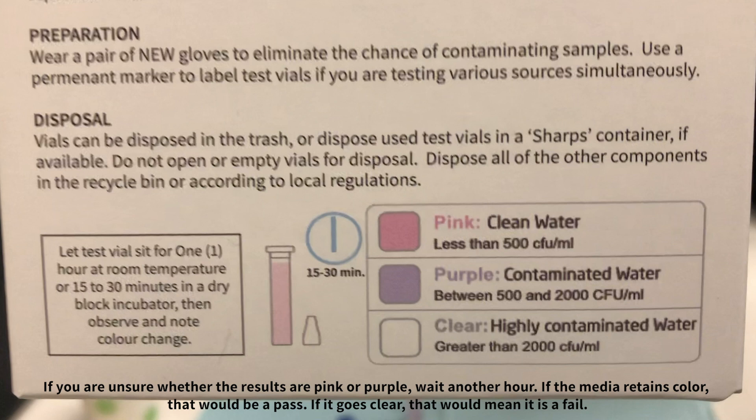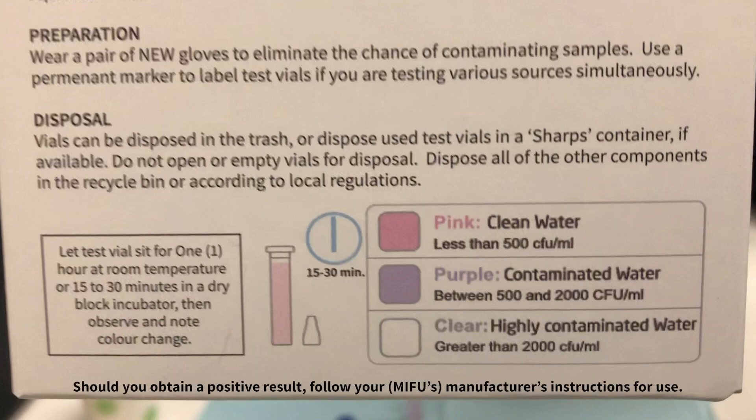If you are unsure whether the results are pink or purple, wait another hour. If the media retains color, that would be a pass; if it goes clear, that would mean it is a fail. Should you obtain a positive result, follow your manufacturer's instructions for use.